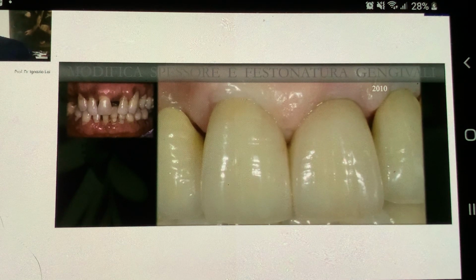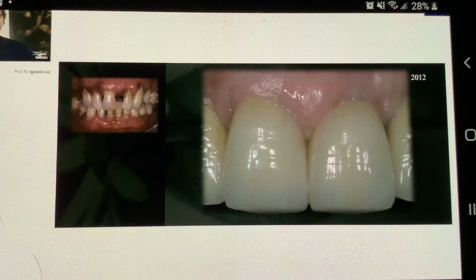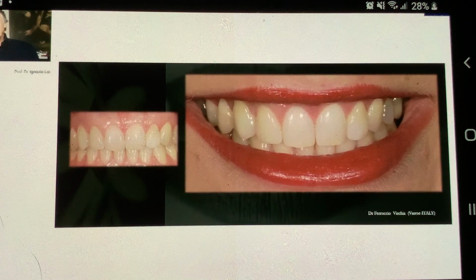So you see here, during the cementing, and then over time, the evolution of the tissues would tend to go towards the coronal part. So BOPT is the technique that actually allows to treat situations which otherwise would require multidisciplinary interventions. Like, for example, here.